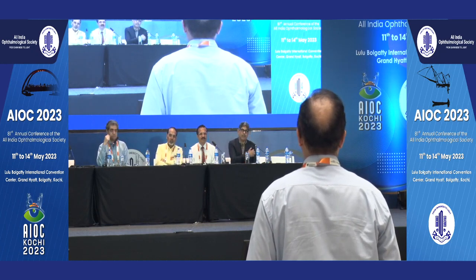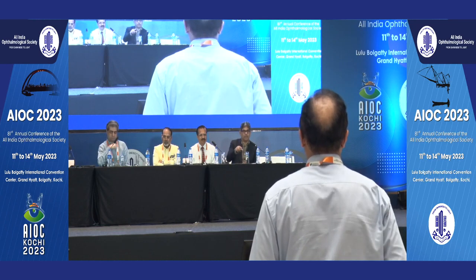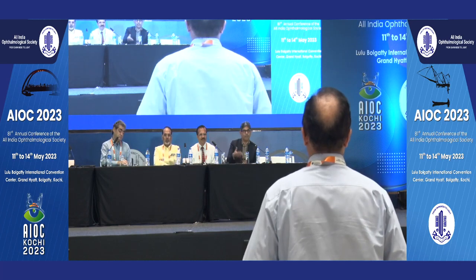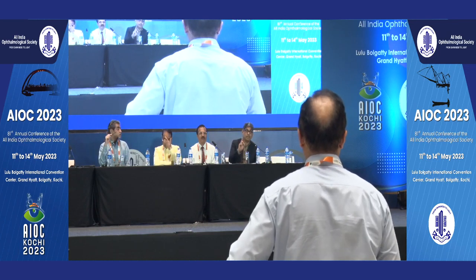I remember when I bought Varion some 8-10 years back, during the early days we used to do a backup marking and we used to have this problem with Varion also. But later on, by upgradation, they have now overcome it. So are you saying that you got a 100% success rate with Callisto? No, not with Callisto, with Varion.